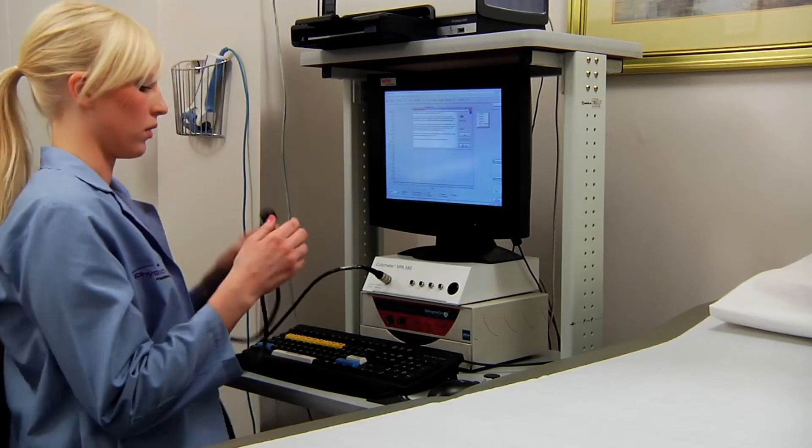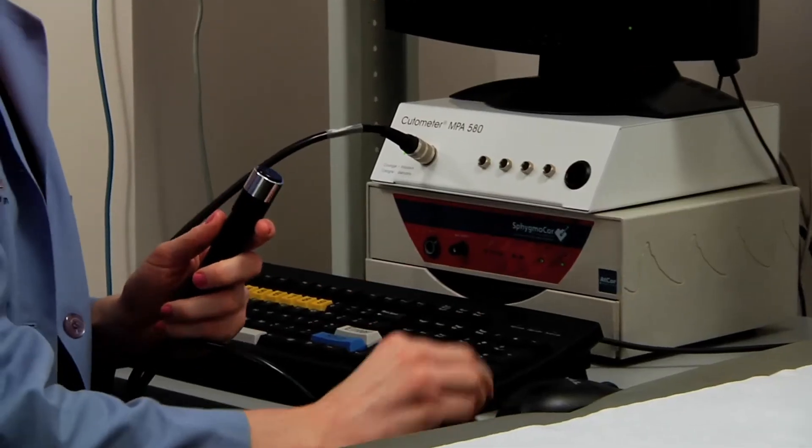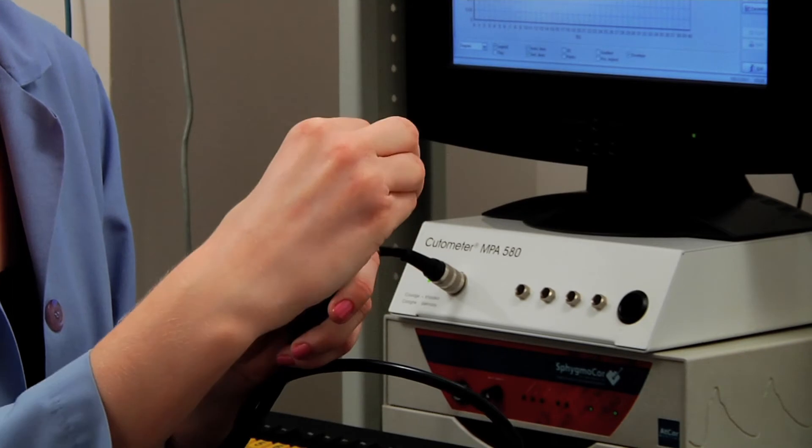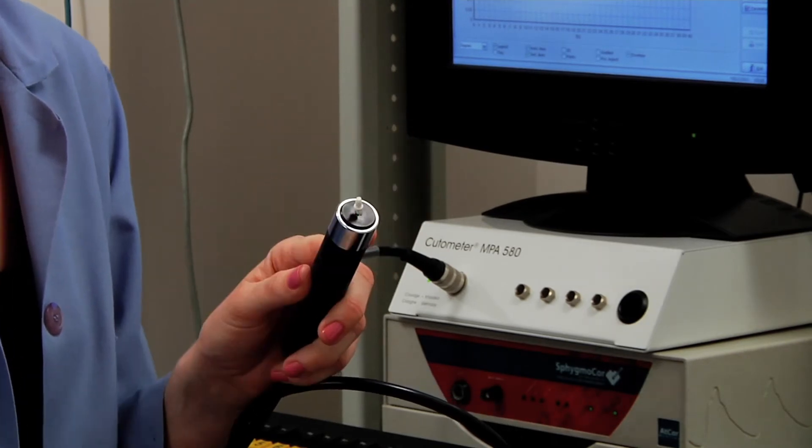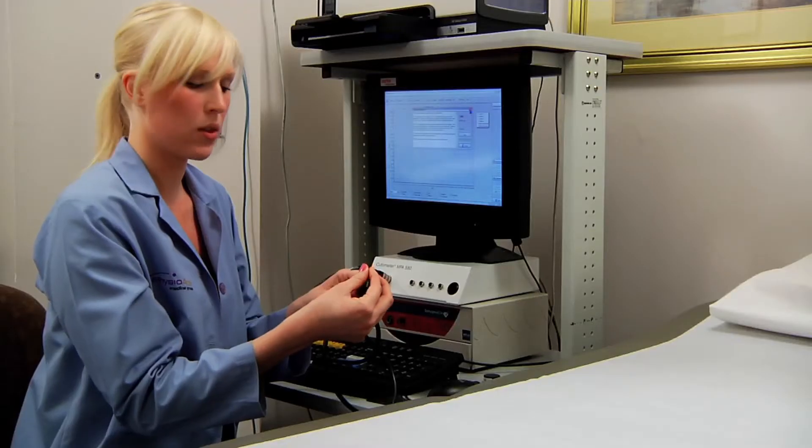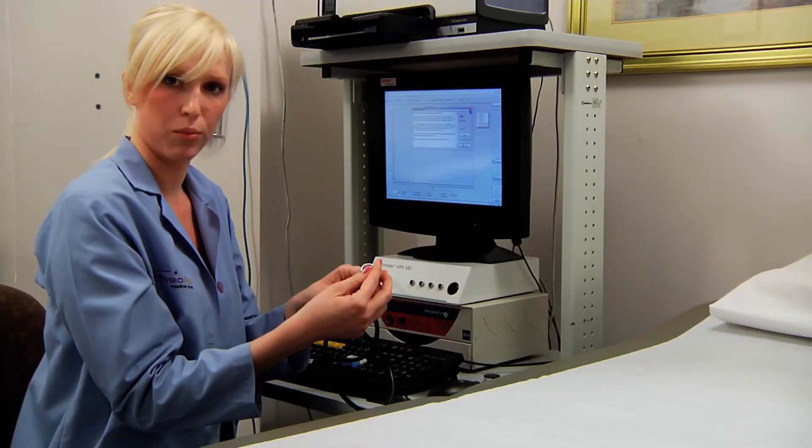Essentially what you'll do, you'll take the lid off. You're going to clean the probe very carefully with this special brush that comes with the cutometer. You're going to place the brush inside of the hole, just gently turn it three to four times. This will help clean out all the oils inside of the probe.